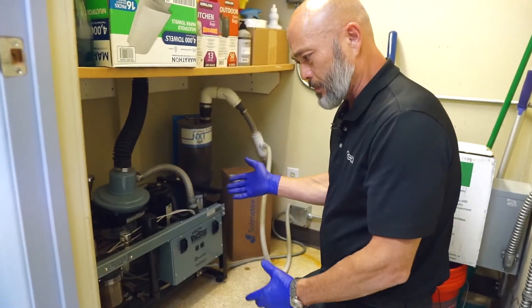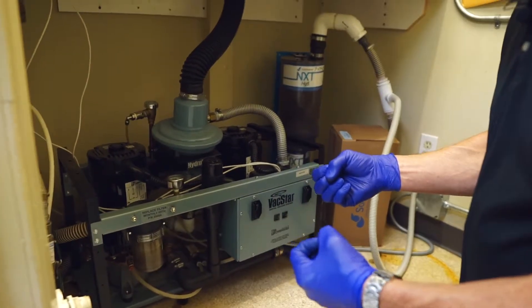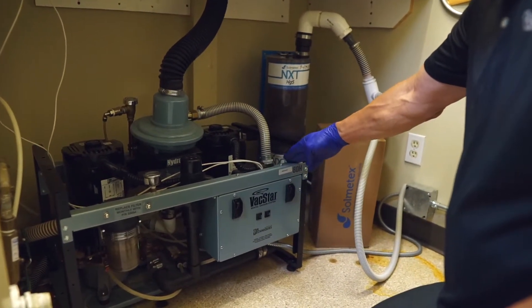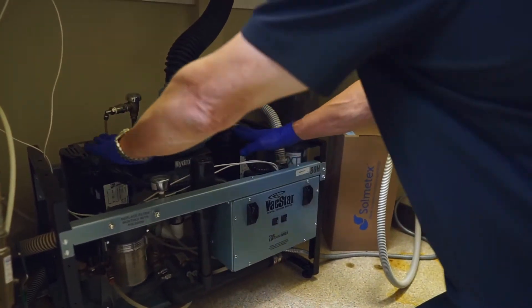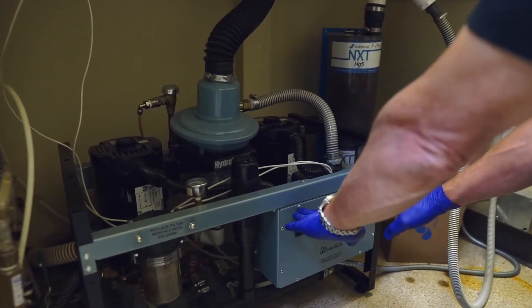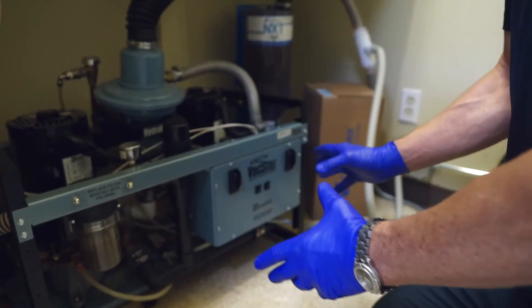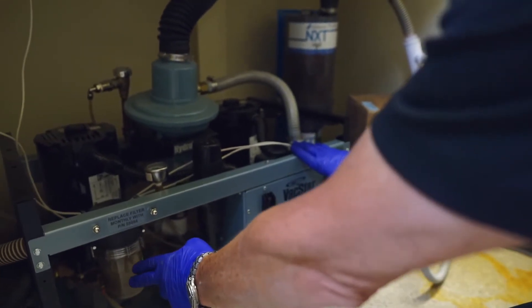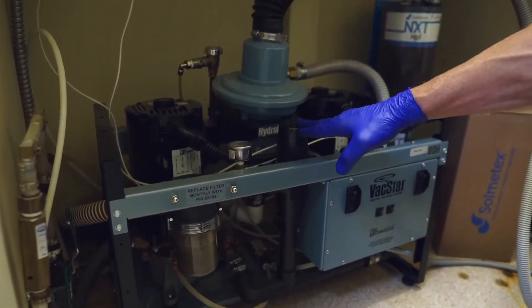Here's your vacuum pump. This is what produces the vacuum — the suction in your operatories. This particular brand is Air Techniques ADH. You've got your two motors here, two breakers here. You should have remote switches that turn these units on and off. And then you have your built-in solids trap, your gauge, and your vacuum breaker.